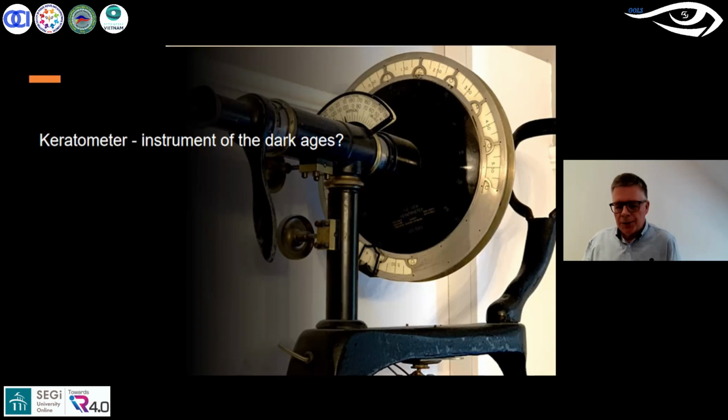Now, this was interesting because for a scientist to prove a theory correct or incorrect was quite an achievement. But Ramsden was very upset. He actually believed Kepler's theory. And as the history books tell us, he threw his keratometer away, and it was reinvented in 1854 by Helmholtz, just 3 years after he'd developed the ophthalmoscope. So the interesting thing about the keratometer is that it was never really developed for contact lenses.